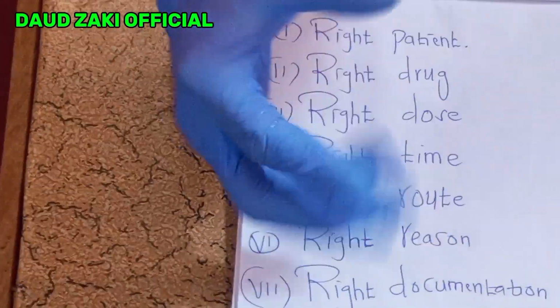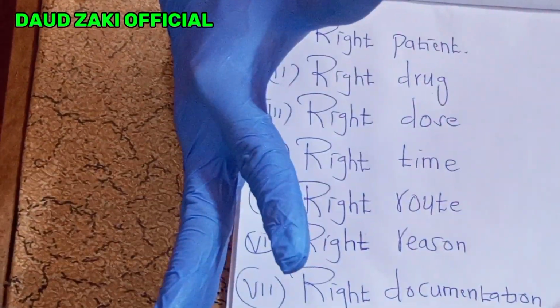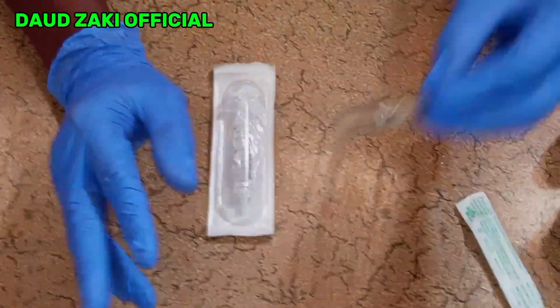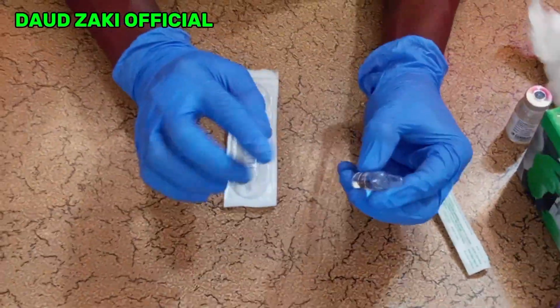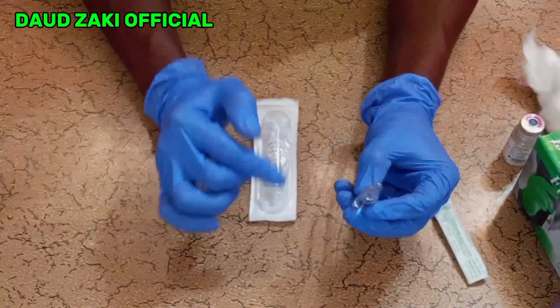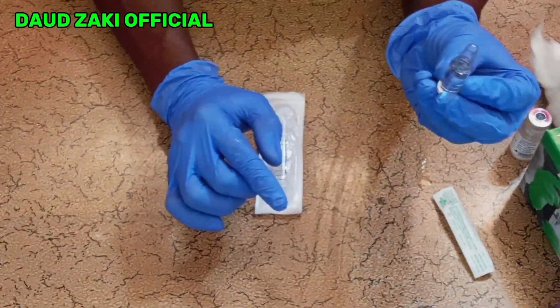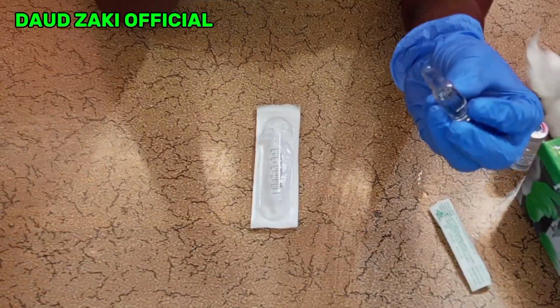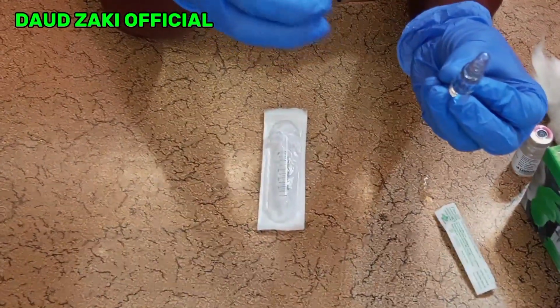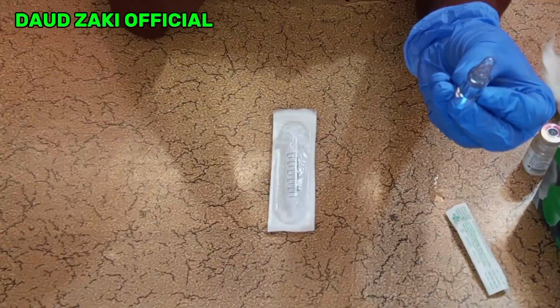Now we shall see how to withdraw drug from an ampoule. If you are preparing a drug in an ampoule, this is how you are going to withdraw it. The drug is already in solution form, that is liquid form. You don't need to dilute or reconstitute. What you need is only to withdraw the drug from the ampoule. I will show you how to break the ampoule and how to withdraw the medication.